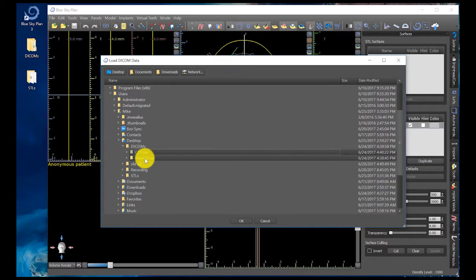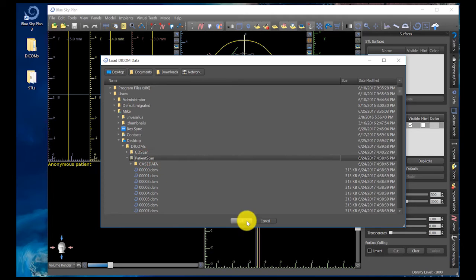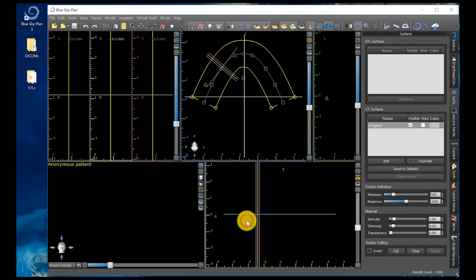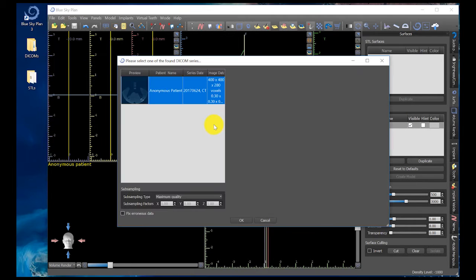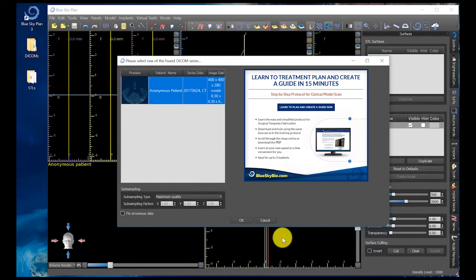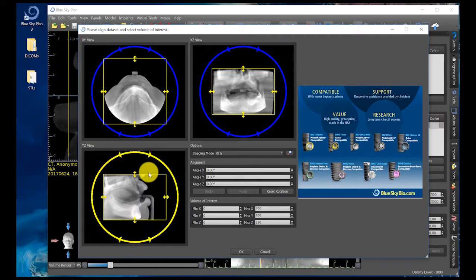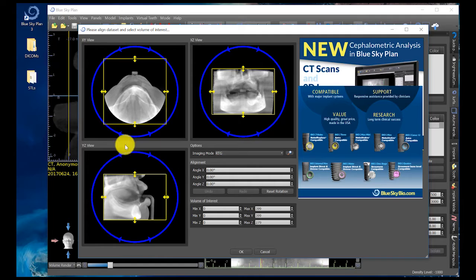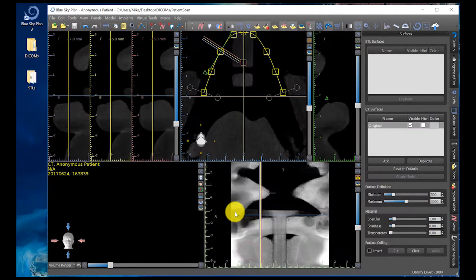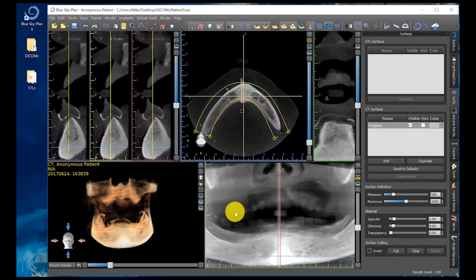We need to click on the patient scan folder and click OK. The software is going to think and load up all of our information. We just click OK. Now it gives us a visual rendering of this particular patient scan. Click OK, and now we've successfully brought this into the Blue Sky Plan software.